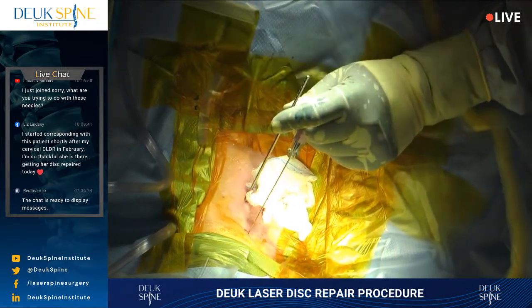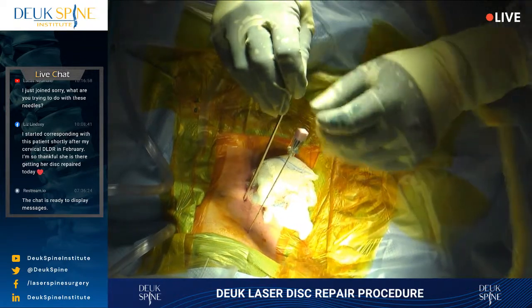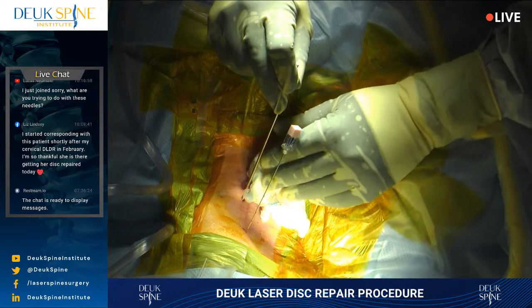Okay, I can feel myself passing through the anterior disc, and we're heading towards the back. And I can take this guide wire out now because I'm inside the disc. So I've safely made it from point A to point B, point A being the skin and point B being the back of the disc. I'm almost at the back of the disc.